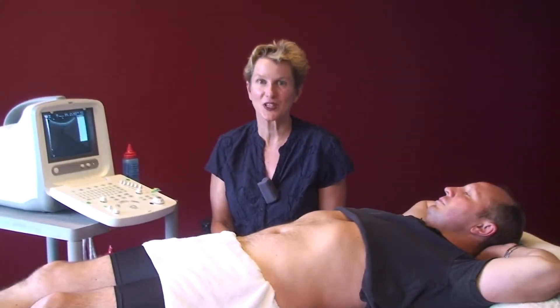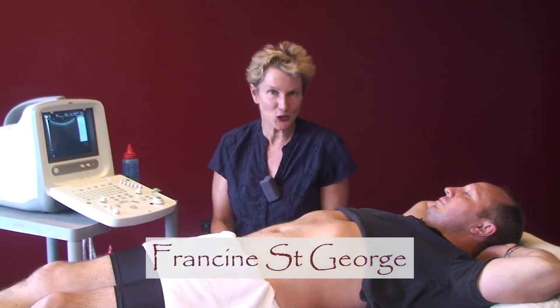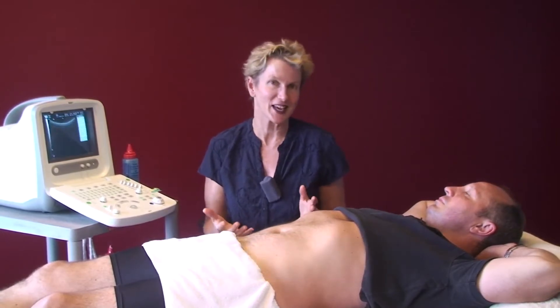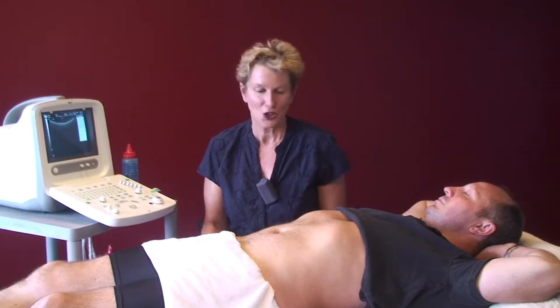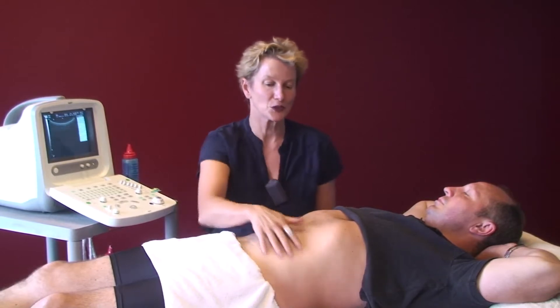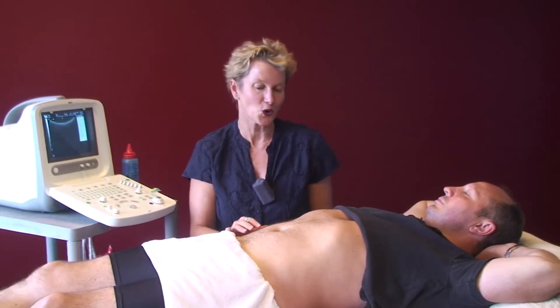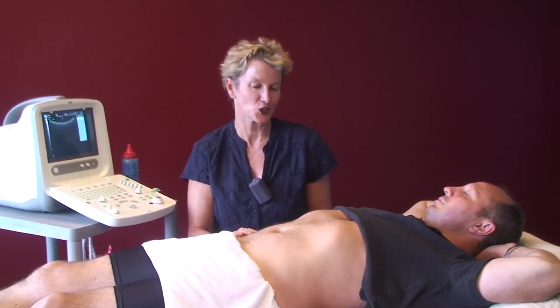Now we're going to assess transverse abdominus. Before we even use the machine, let's ask the client what they understand by a transverse abdominus contraction. So Alex, what I'd like you to do — you know I've taught you about your inner core — I'd like you to show us what you do when you're doing your transverse abdominus contraction or your core stability work. What does that mean to you?